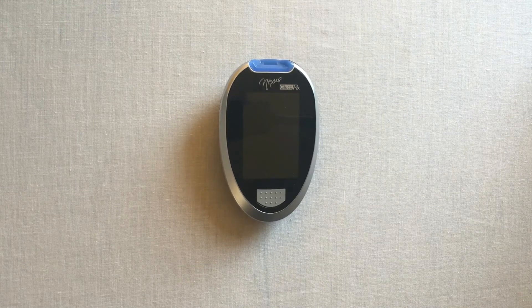Welcome to the demo video for our GlucoRx Nexus meter. Here we will be covering how to review readings.